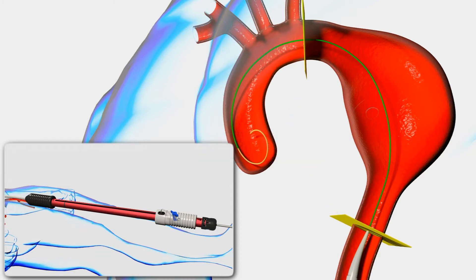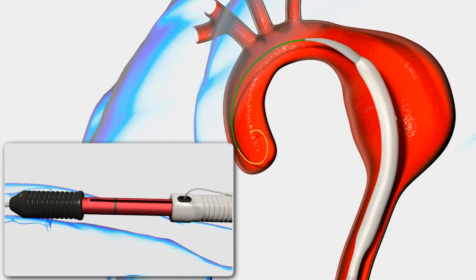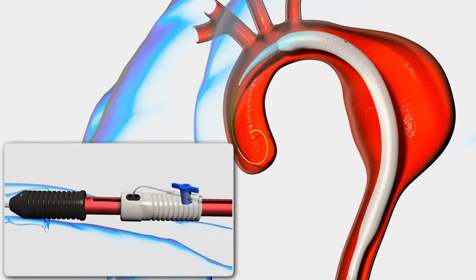While holding the black stationary grip, push the gray deployment grip forward, completely advancing the inner sheath. Verify that the gray deployment grip has reached or passed the black line on the handle.